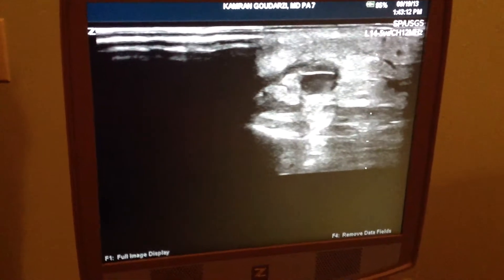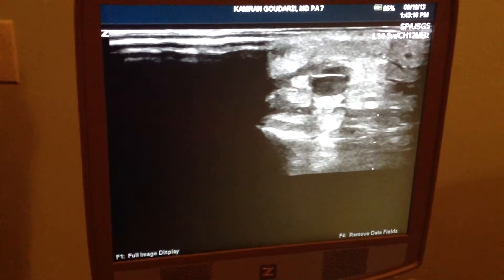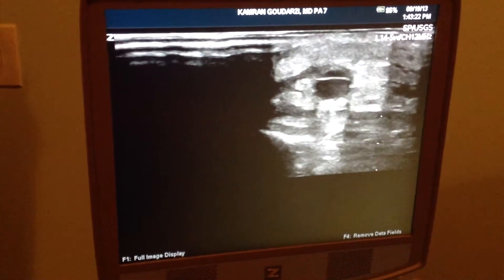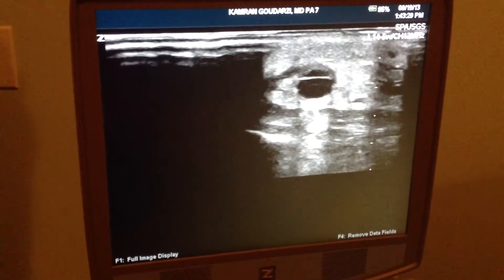This is a section of the long saphenous vein at the ankle, in the vicinity of a Cockett's perforator. You can see both valves. You can see the blood going back and forth. I'm squeezing the foot and then letting go, and you can see it fills right back up again.